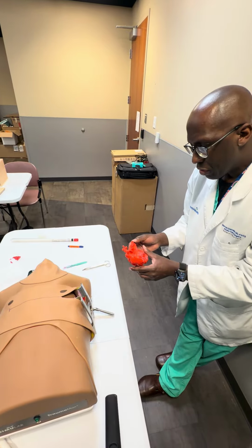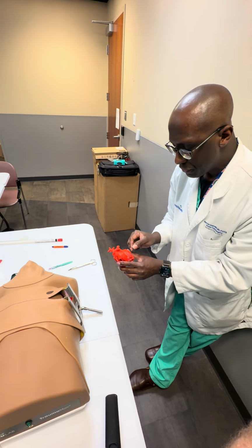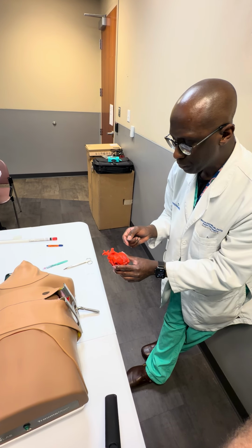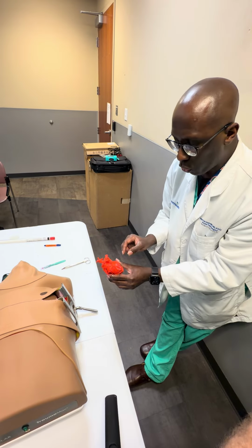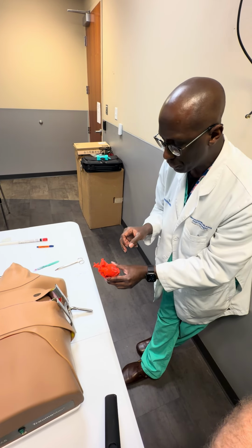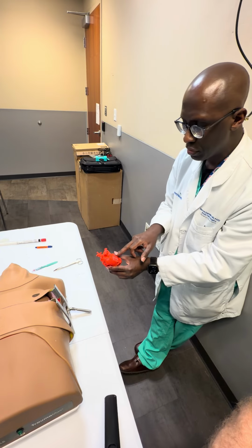I'm going to inspect the heart, make sure there's no obvious injury. Obviously, if there's any kind of puncture wound or stab wound or any kind of bleeding hole, you can use your finger, you can use a Foley balloon. You don't want to ram your finger through, but essentially occlude the bleeding area.